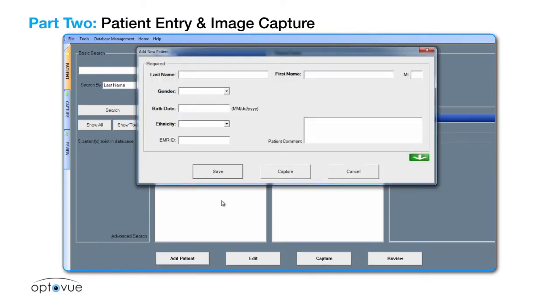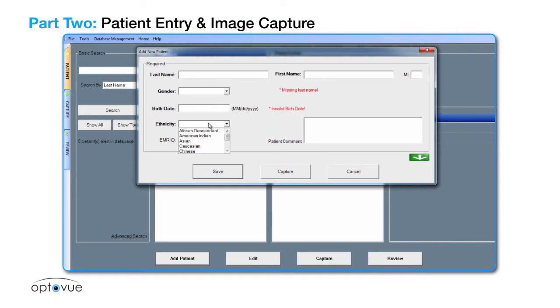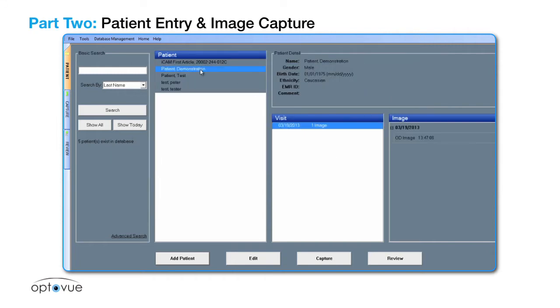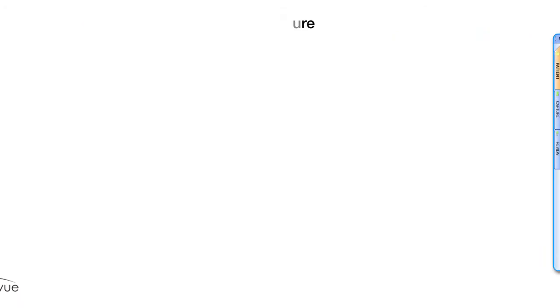Click on add new patient. Enter last name, first name, gender, date of birth, and ethnicity, then select capture. If the patient is already entered, click search or show all, click on the name, and select capture.